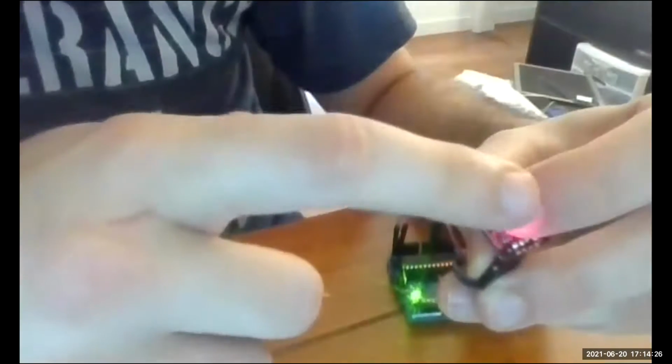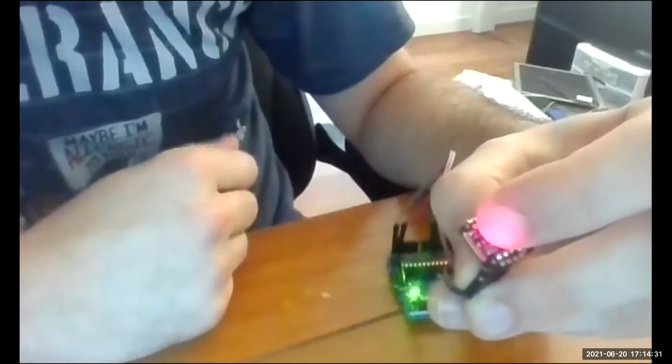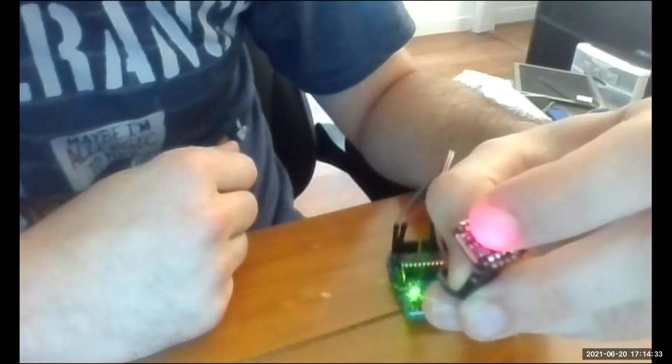I wanted to go ahead and show the basics of the code and how the pulse sensor actually works. So just show you all the sensor that I'm using. It's really, really cool because it uses infrared light. You can see the infrared light actually penetrates through my finger, and that's part of the lesson today.